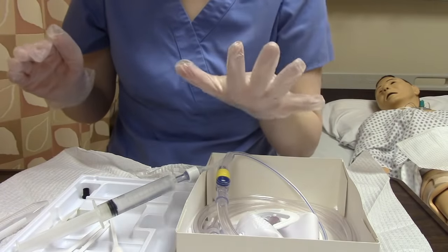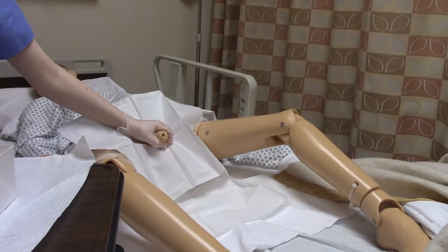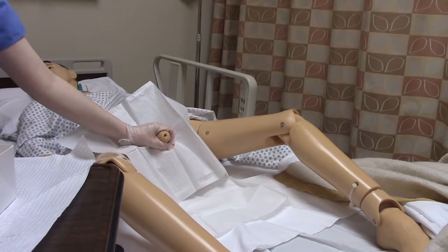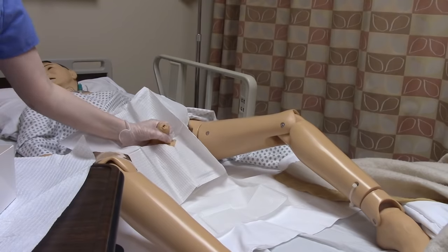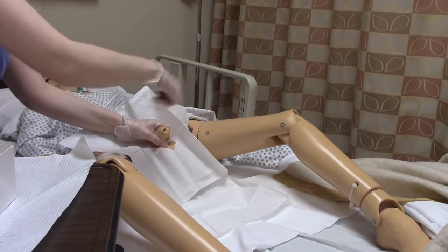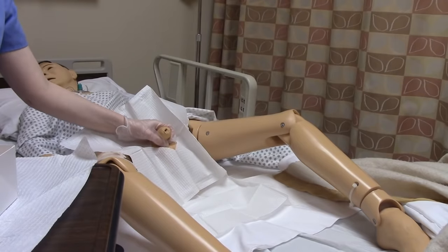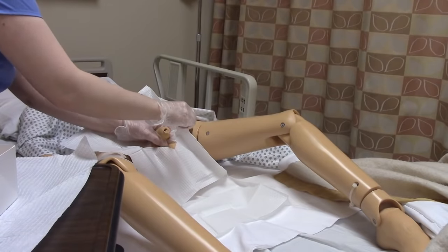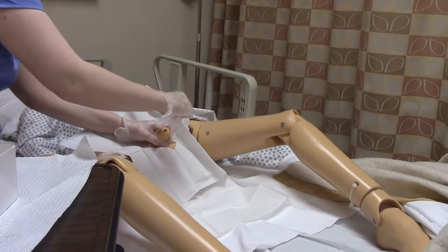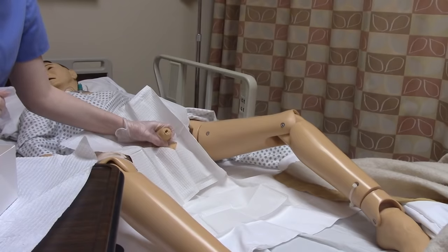Now we can touch the patient. I'm going to take my non-dominant hand — my left hand — and contaminate it by touching the patient. With a male, take the penis and point it straight up toward the ceiling in a comfortable manner. Take your three swab sticks: use one to go around the closest part one time only — not back and forth — then discard it. Take the second one slightly lower, go around once, discard. Finally the third one all the way down, discard. If the patient is not circumcised, pull back the foreskin to do this.